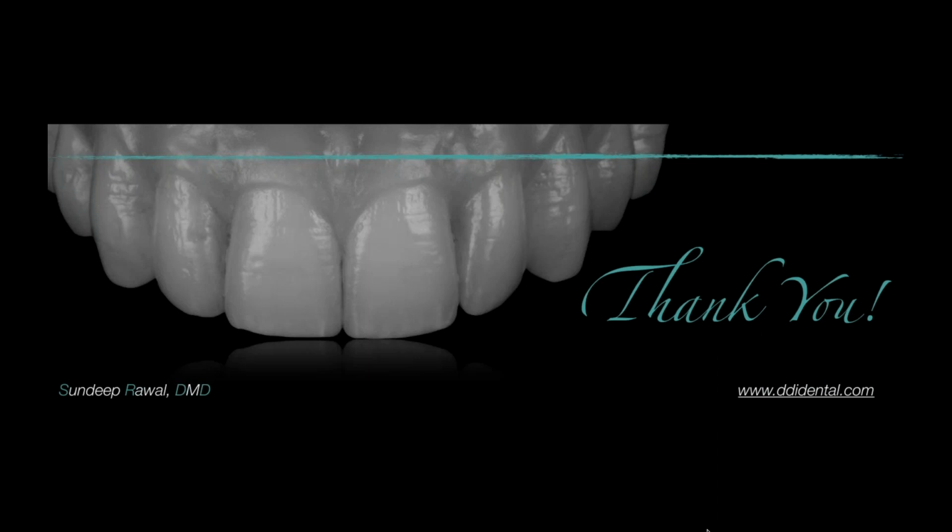Whereas the next iteration is taking the best of dynamic navigation and the best of static-based resin-guided technology, and that is robotics today. Predominantly, the only FDA-cleared system in use today is the Yomi system from Neocis. The Yomi system allows us to place an implant utilizing robotically driven guidance.